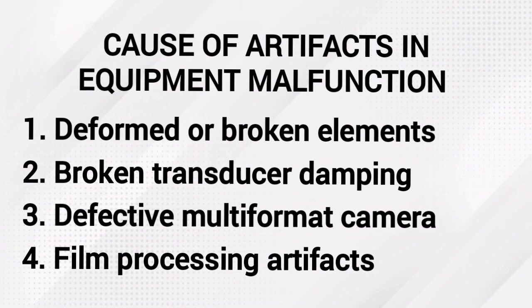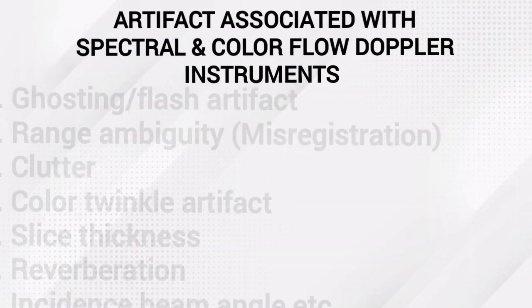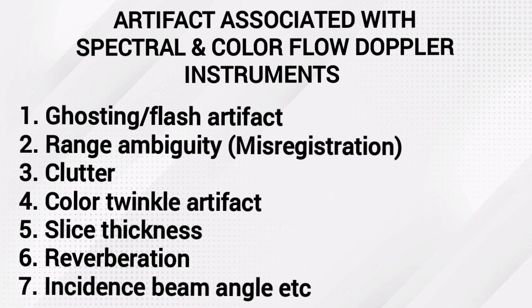So equipment malfunctions may cause various types of unusual artifacts, such as deformed or broken elements, broken transducer damping, defective multi-format camera, film processing artifacts, and so on. Artifacts that are associated with spectral and color flow.